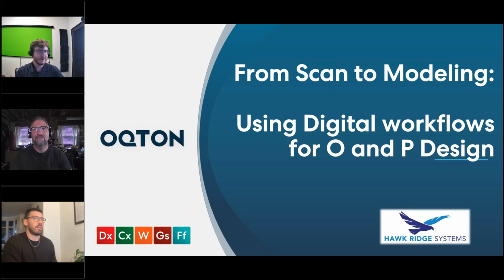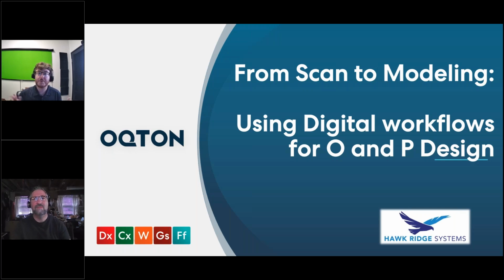Well, thank you for the introduction, Guy. Hi, everybody. My name is Matthew, and as mentioned, we're going to be talking about scanning and modeling, and specifically using digital workflows for O&P designing. We have a traditional mindset of how we make different prosthetics or medical devices. What we're going to talk about today is a digital version of that workflow, where it can fit in, and where we see professionals and patients benefit from this.